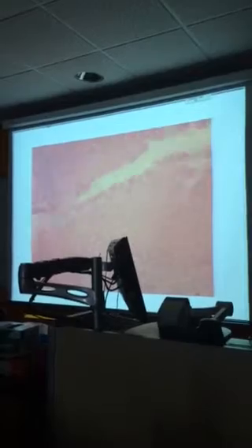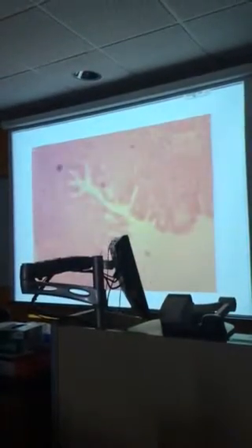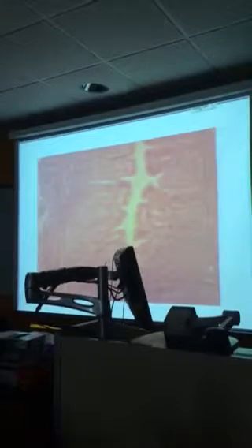All right, let's look at another slide. This one also is a stomach esophagus junction. And here we see it again.